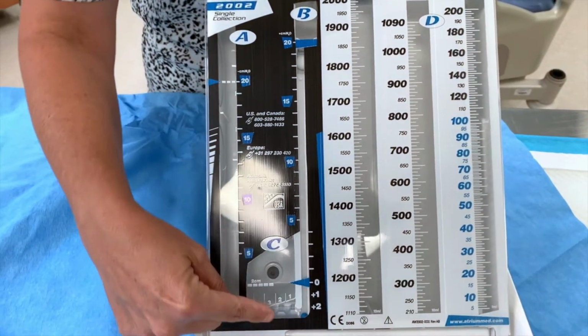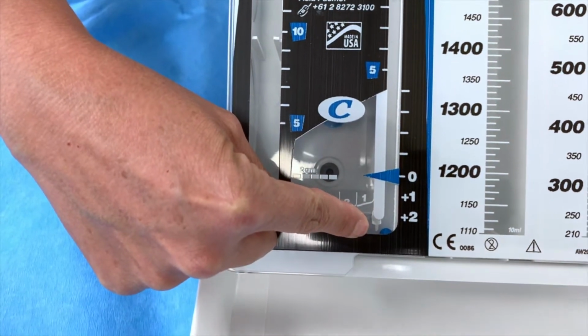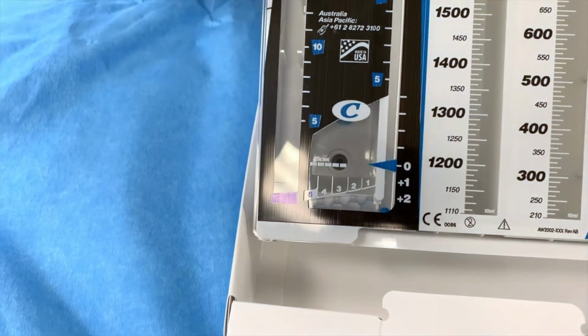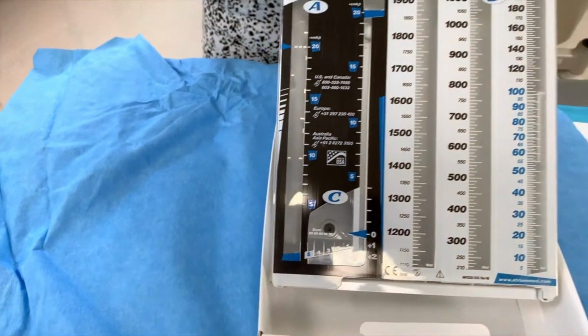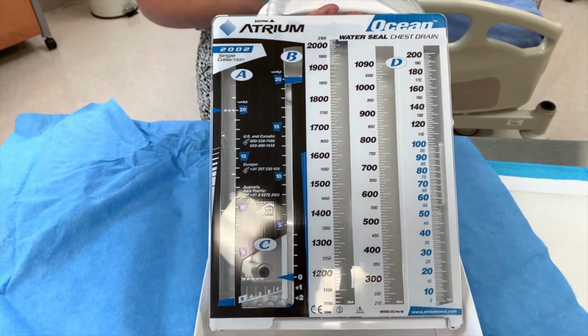You also see the little blue bubble right there? This is where you will normally see that tidaling. When the patient breathes in and out, it will go up and down, and you'll see tidaling. That's just the inspiration and the expiration of the patient when they're taking a breath.